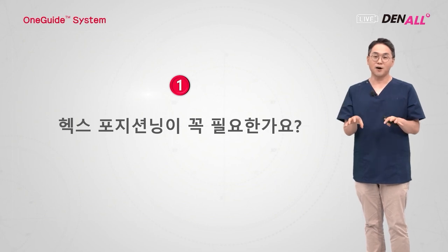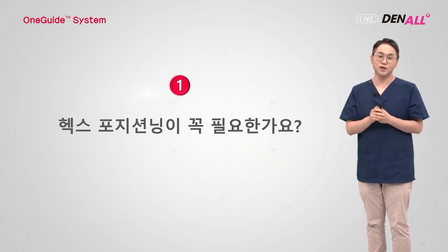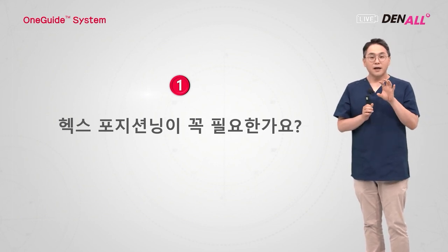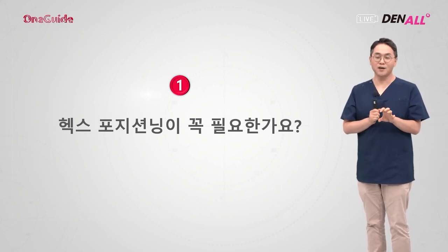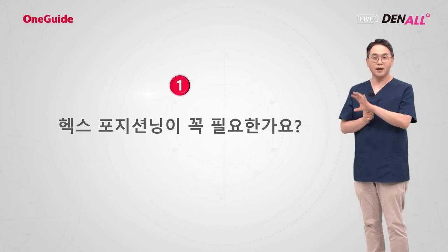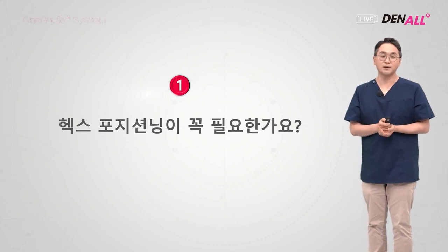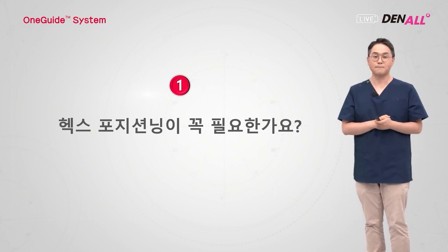After placing the implant, if a prefabricated abutment and temporaries can be used for immediate loading, then this is necessary. But if you are using an abutment without hex, hex positioning is not important. The prefabricated abutment, if it is a hex type, hex positioning is necessary. Otherwise, this is not absolutely necessary. If you are not going to do the immediate loading and if it will be loaded after the osseointegration, this is not that meaningful, but apical coronal depth control should be done.